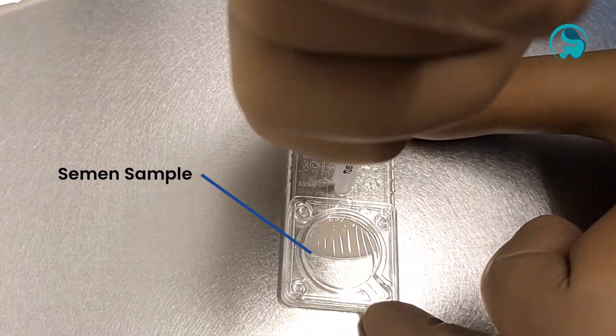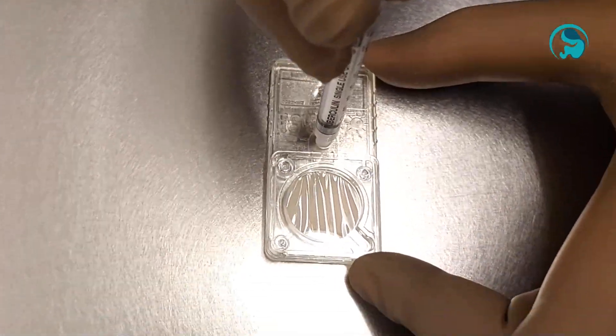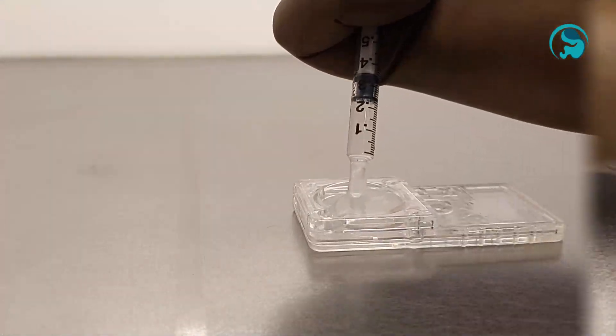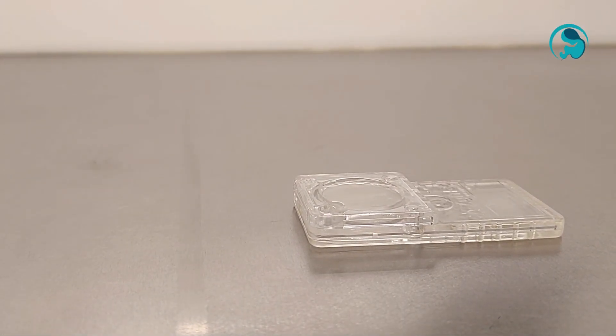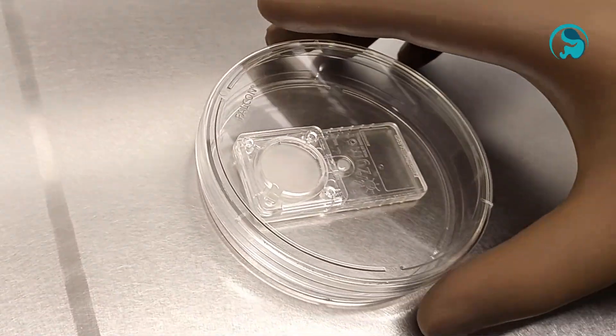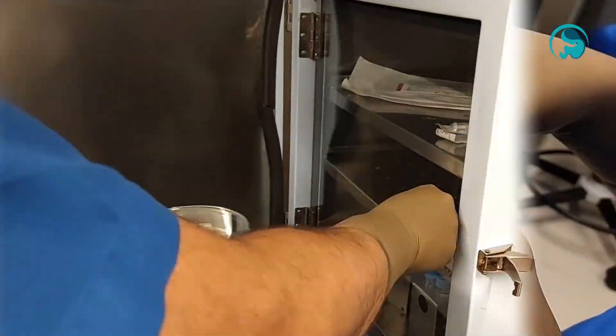The semen sample after liquefaction is slowly injected into the device. Appropriate amount of media is added to the top of the membrane and the device is then kept in an incubator for about 30 minutes.